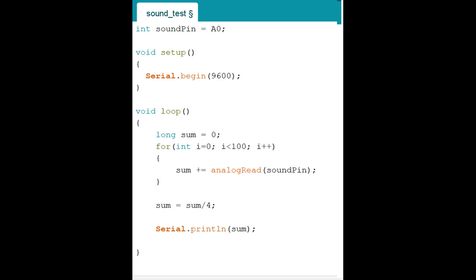It's the same thing with the computer. I just said whatever I want to say, it's over, semicolon. So if there's no semicolon, then you will see the error. Okay, now you press enter and go to the next line.